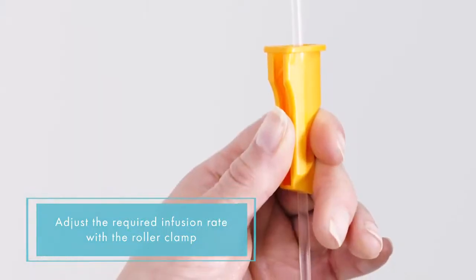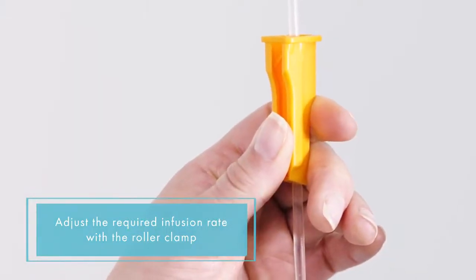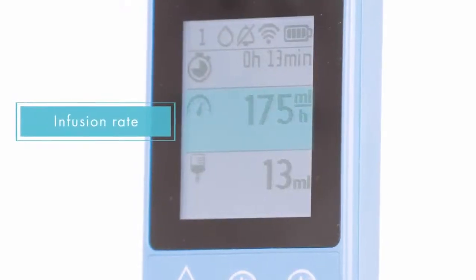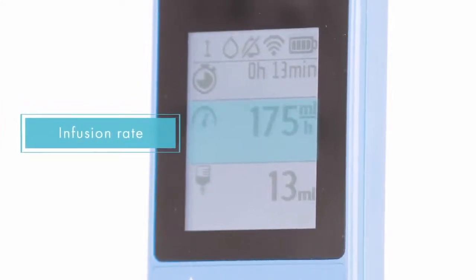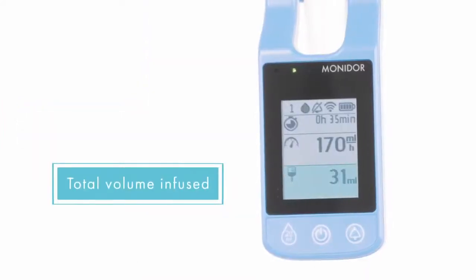Adjust the required infusion rate with the roller clamp. The device displays the accurate flow rate. The MoniDrop displays the total volume infused and the total treatment duration.